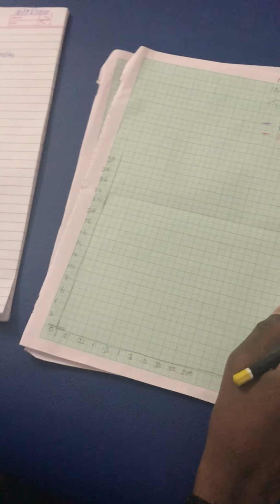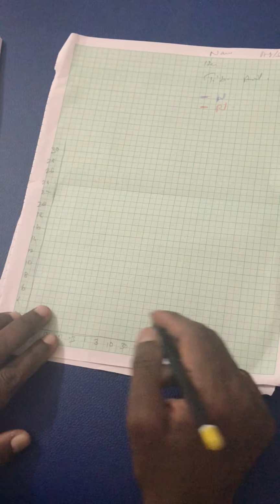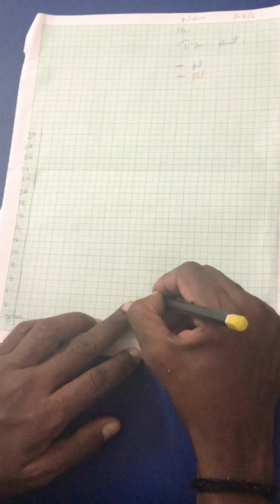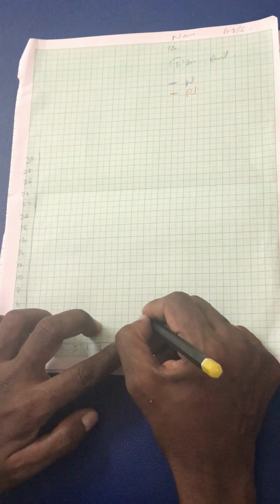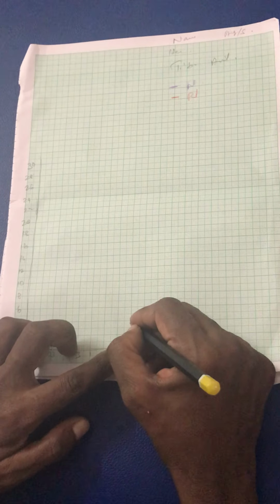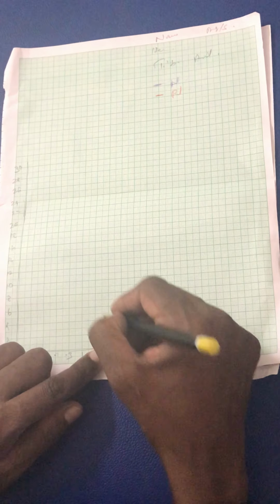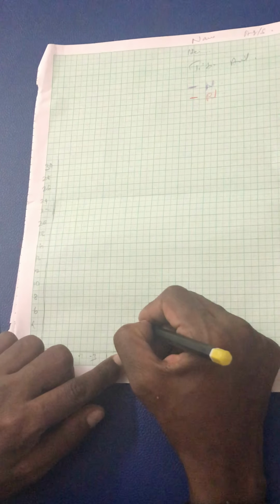Okay, now I am going to choose the duration. At 300, the value is 3.8, and the axis shows 3 and 4, so 3.8 is here. I will mark this down. At 100, it is again the same, 3.8. And 30 is also almost at the same place, 3.8. Now 10 is 4.3. Here this is 4 and this is 5, so in between 4 and 5 it should be here.